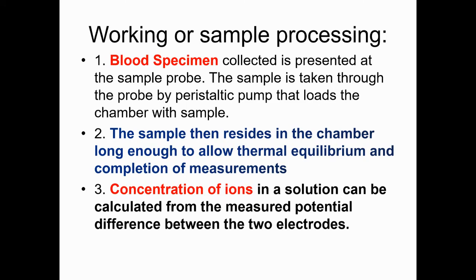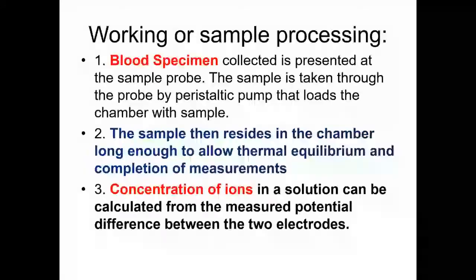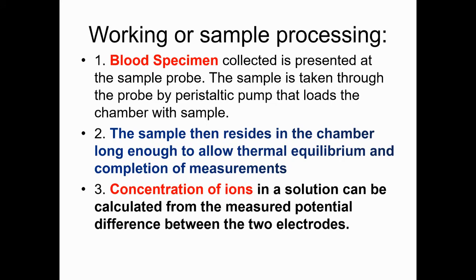So the second step: what happens once the sample is loaded by the peristaltic pump into the chamber? The sample then resides in the chamber for a long time. Up to what time? Up to allow the thermal equilibrium. It goes for thermal equilibrium for the completion of measurements of all the electrolytes.